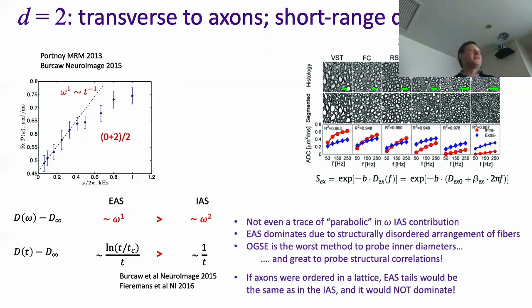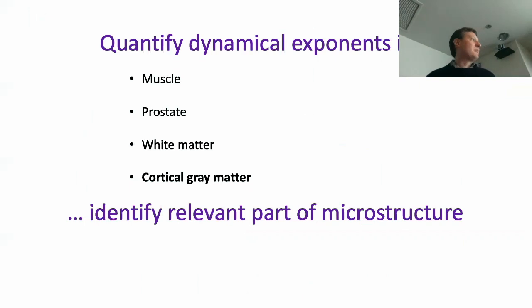So we're probing the geometry of extra-axonal space, but I think it's actually more exciting, because demyelination, axonal loss, glial infiltration, inflammation actually happen from outside, geometrically speaking. So actually, it's probably good news. Maybe we should forget about inner axonal diameters and not have just a single focus on them, because that has been for a long time the mantra in white matter modeling. Let's look at extra-axonal space, because from the pathology point of view that maybe gives you more interesting results. So that's kind of where we are today.